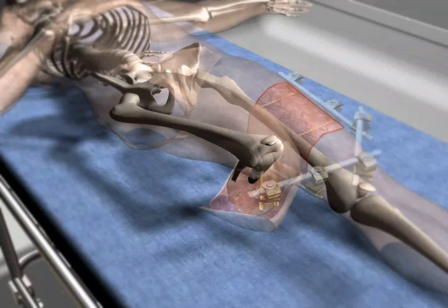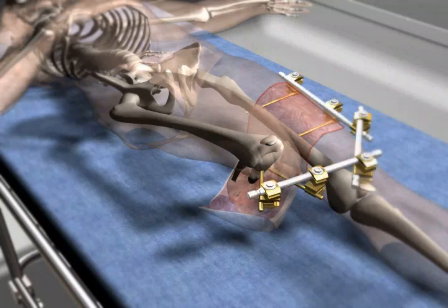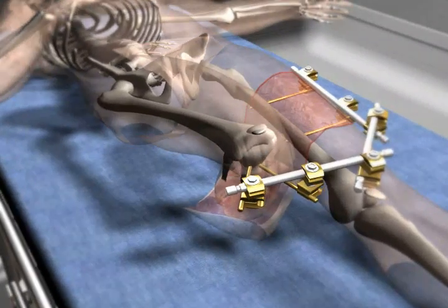The tube-to-tube frame, using tubular external fixator, was applied to stabilize both limbs to allow the graft healing.